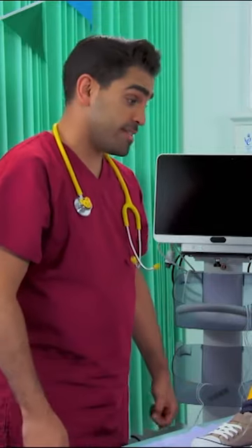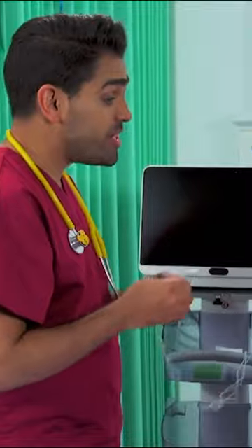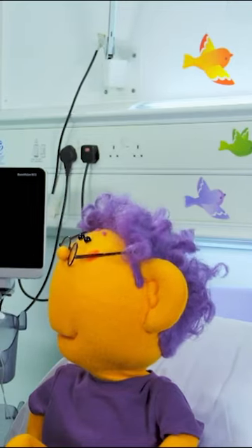I'm going to need to put some sticky sensors on your scalp, which I need to clean first. Are you going to cut my hair off, Dr. Range? No, Riz, I don't need to cut your hair, but you might want to wash it when you get home. These sticky sensors are quite sticky. OK.